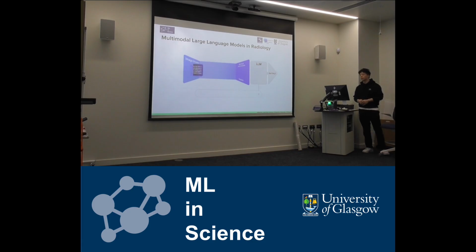This kind of model can handle two classical tasks. One is visual question answering, where the model receives the medical question and generates a short answer like here. Another task is report generation. Instead of giving a short answer, the model must generate the full medical report, which normally requires a much deeper understanding of the whole chest X-ray. And this is the task of my focus.